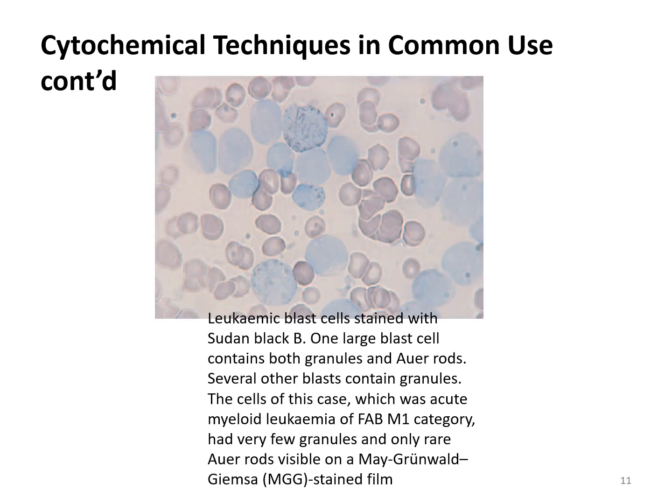This is the appearance of a blood smear that was stained using Sudan black B. It's not exactly black, but more grayish in color for the red blood cells, and you can see granular deposits in the cytoplasm, and those rod-like structures, which are Auer rods.